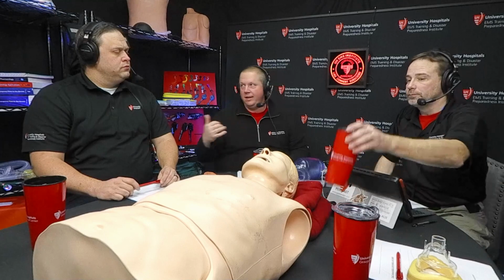And then kind of to piggyback off of that point, if we're going to take this patient that's on a ventilator, we were talking off air even before we started, some of us have areas that we cover with ventilators. So I'm going to take this patient that was a ventilated patient that is on PEEP, and then now I'm going to move them to a BVM without PEEP. So there's a lot of factors going in there that are all BLS skills: knowing how to use your BVM, what your rate is going to be, what your tidal volume is going to be, and did I take them from a unit that had PEEP to a unit that does not?